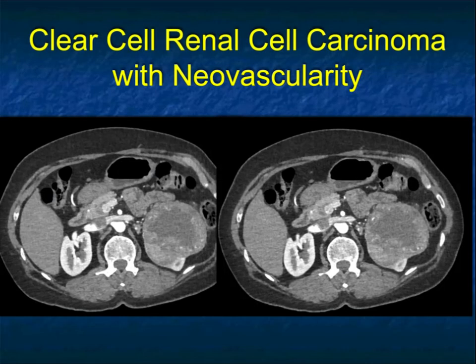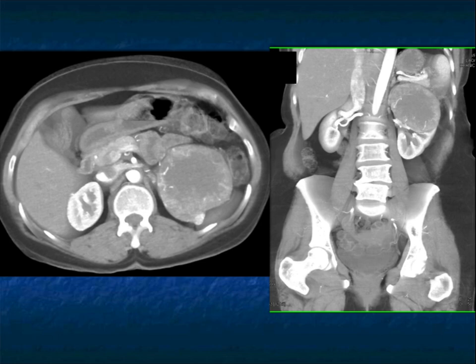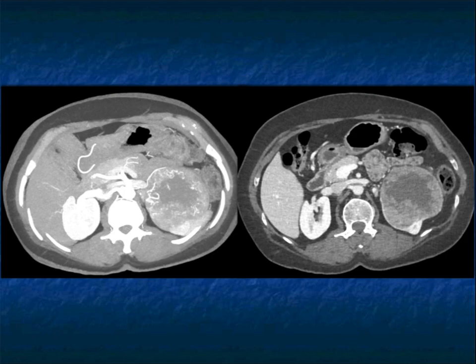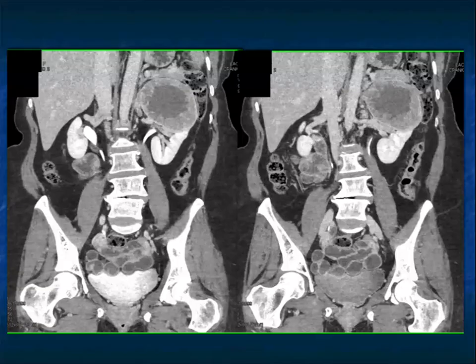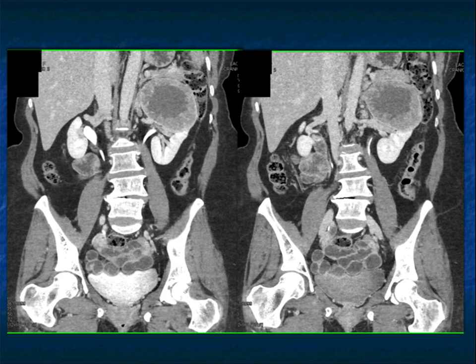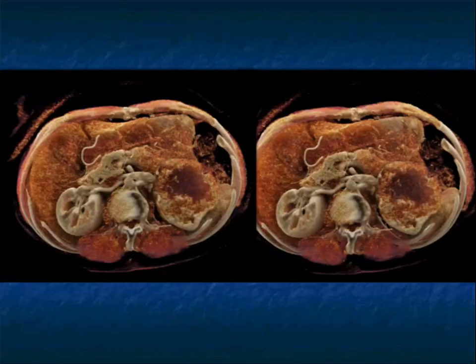With clear cell renal cell carcinoma, neovascularity is very important and can easily help in making diagnoses — cases with neovascularity tend to do poorly. In this case there's extensive central necrosis with neovascularity around the edge of the lesion. MIP imaging is very helpful to visualize the neovasculature. On the coronal MIP view and excretory phase, you can see the necrosis, tumor nodularity around the periphery, and what looks like a pseudocapsule. Cinematic rendering will help with texture mapping and looking at lesion aggressiveness as we move into radiomics.